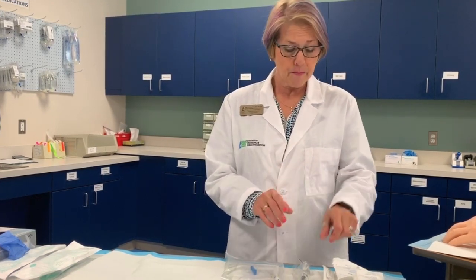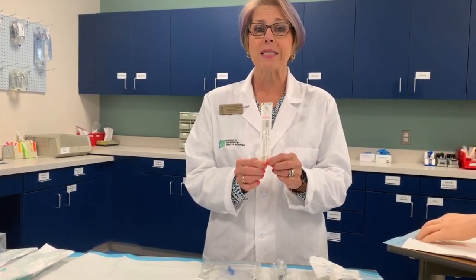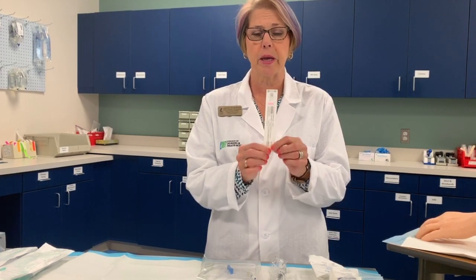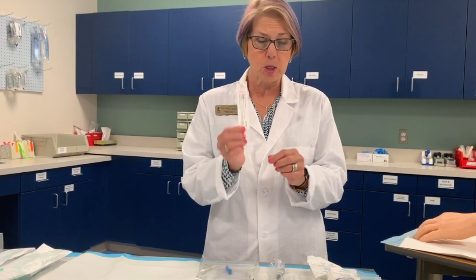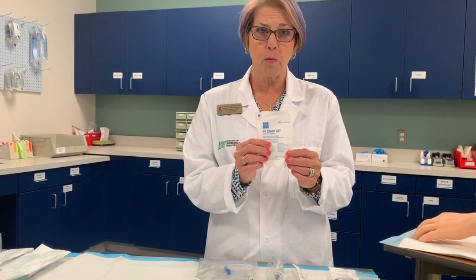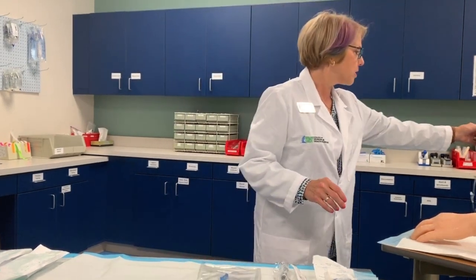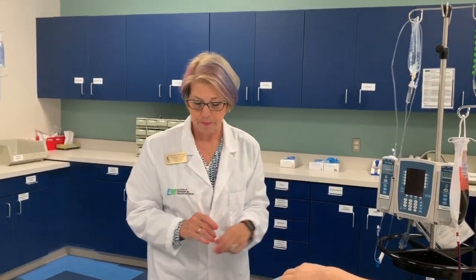So to start an IV, you're going to need your IV catheter. And knowing what the patient is getting will help you determine what size catheter you want. I usually start with at least a 20 gauge catheter. That's a pretty safe size to give medications and fluid. We can even give blood with a 20 gauge catheter. 18 gauge is sometimes preferred, but a 20 gauge will be a good starting point. You'll need your IV start kit, and we're going to go over what's in that in just a moment. You'll need a flush syringe with your normal saline, and either an extension set or your IV tubing if the patient's going into the pre-op setting and we're going to connect directly to IV fluids.